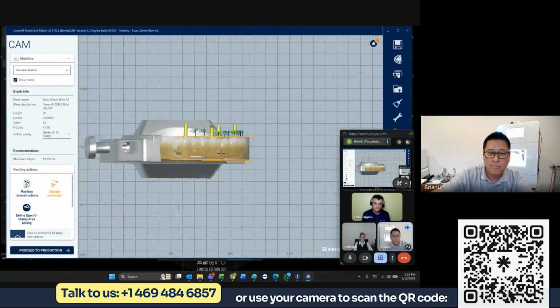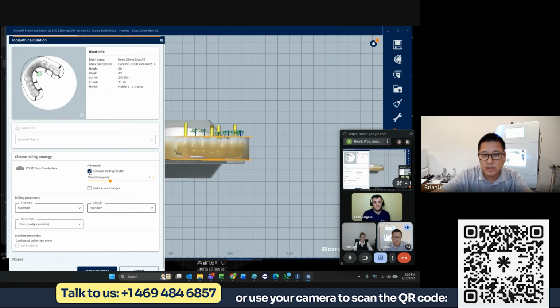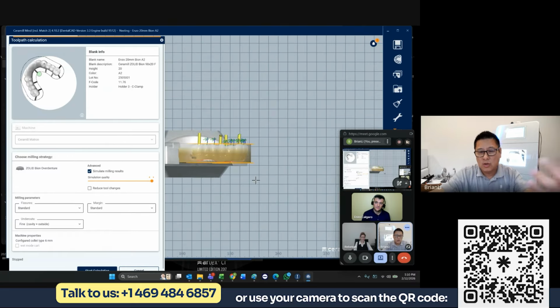Okay. Nice. All right. So now when we go next, I would just want to show you guys a couple of features in our CAM software. And that is number one, to show the simulation results. Anyone who does full arch cases knows that it's important to know what the simulation shows you in terms of problem areas, or certain areas in the restoration that it will not mill out. So this is important to have.